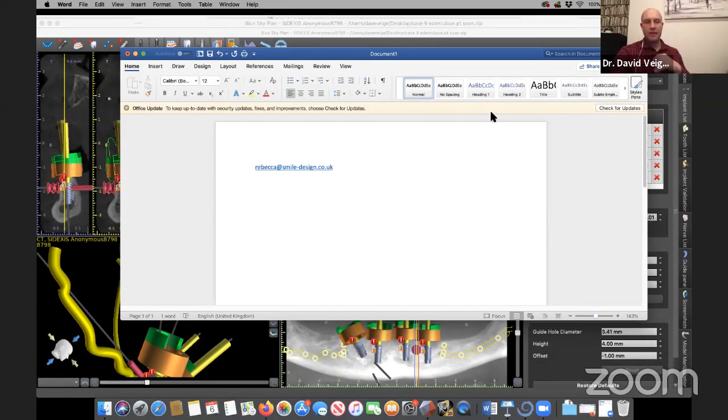Once the implants are placed, again, I plan my prosthesis, I plan my implants. I then take my prosthesis out of the BlueSky Bio. I delete out the abutments, which are going to be in the right positions of my implants. I put on my multi-unit abutments onto the implants, and then I put my temporary cylinders. A temporary cylinder is basically just a temporary tube which screws into the multi-unit abutments. I then put my temporary prosthesis over the titanium cylinders, and I bond it on with a resin.